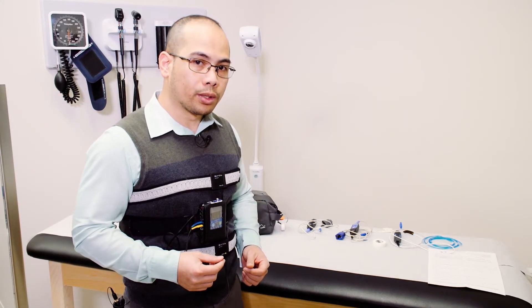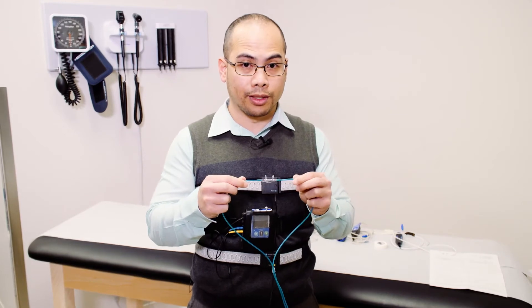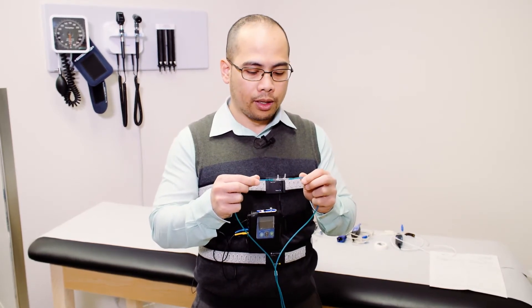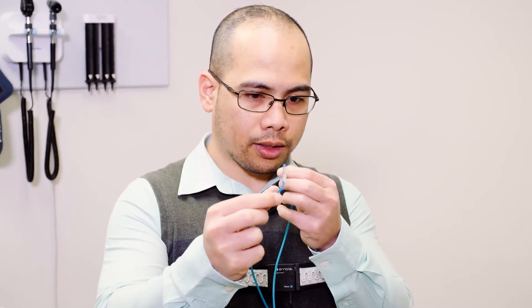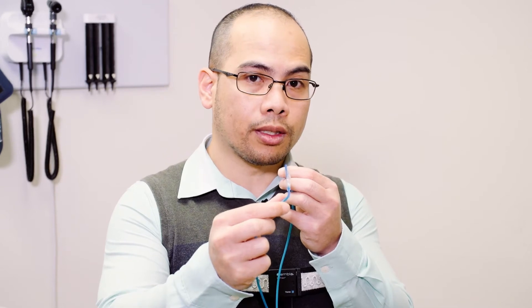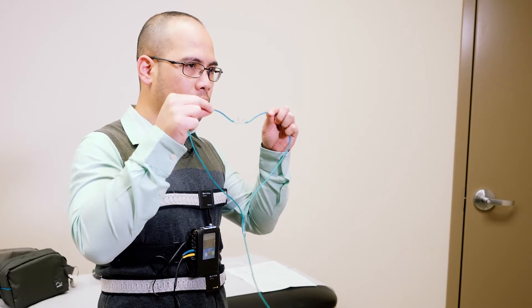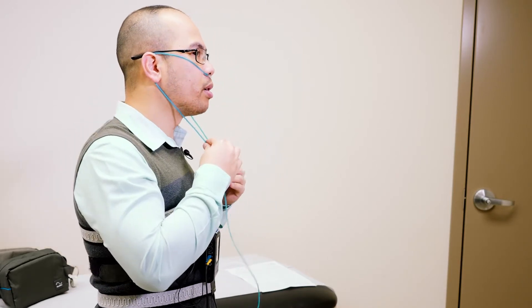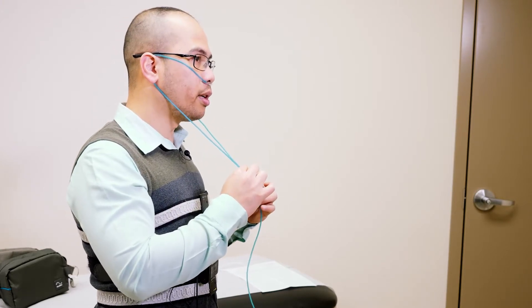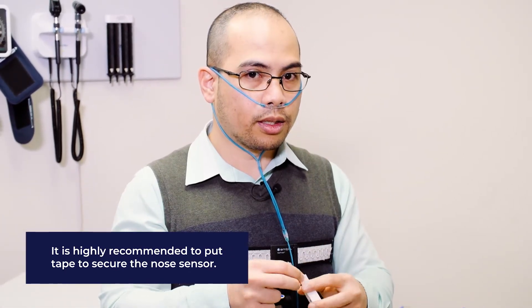The next one would be the nose sensor. This nasal cannula is the same cannula used with oxygen supplementation; however, in this particular test it's not doing that. This is to monitor the flow of air in your upper airway when you're breathing in and breathing out. The prongs have a certain curve and need to be placed into your nostrils with the curve pointing inward. The prongs go into your nostrils while the rest of the tubing goes up and over your ears and loops around your chin, like so. There's also a slider which you can tighten so that it's more stable and stays in place. You can also put tape over the tubing so that it's more stable.